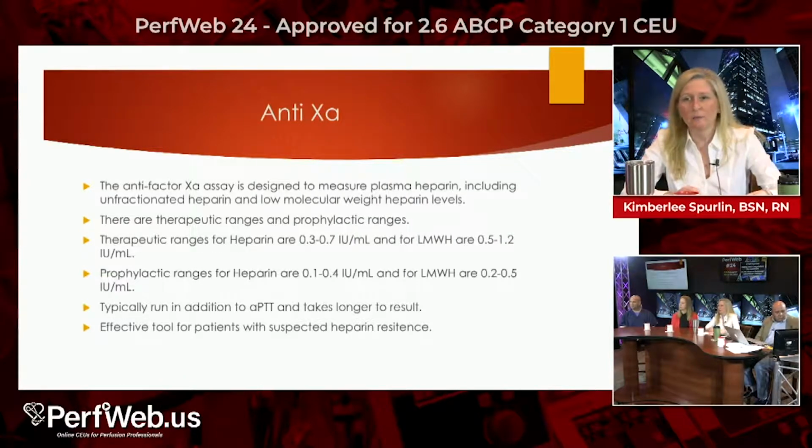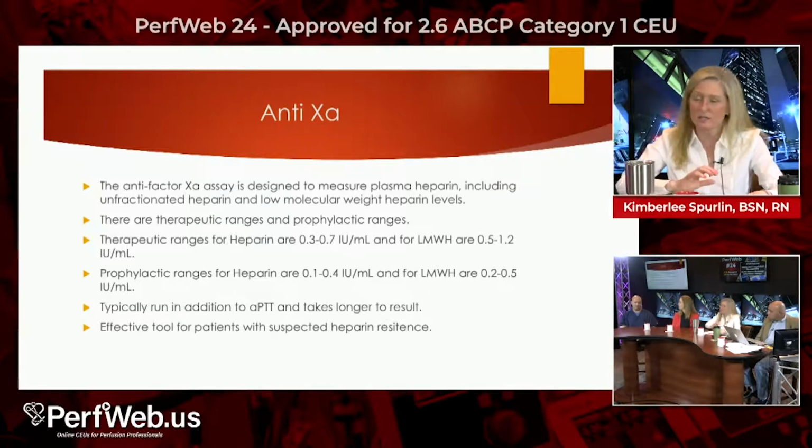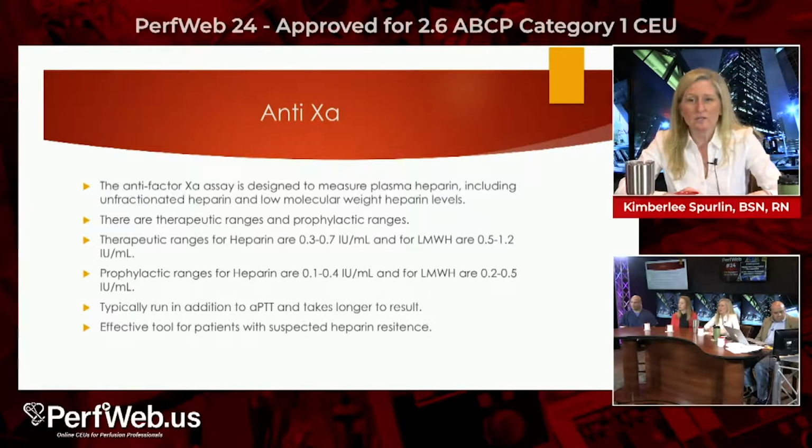And then anti-10A. I'm starting to see this more at my facility. I can't speak for downtown. Do you guys do anti-10As? No. So the antifactor 10A assay is designed to measure plasma heparin levels, including unfractionated heparin and low molecular weight heparin. I'm seeing it more in the low molecular weight, looking at whether they're therapeutic, especially in our trauma patient population.